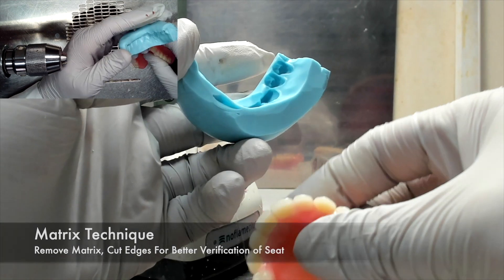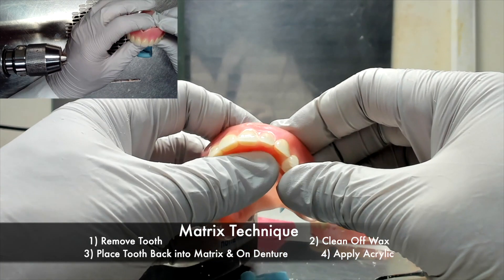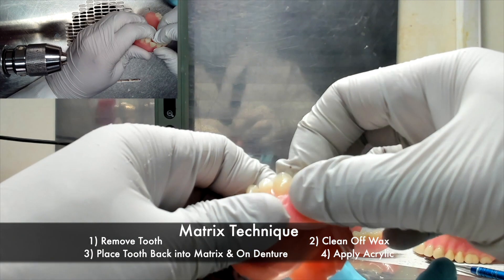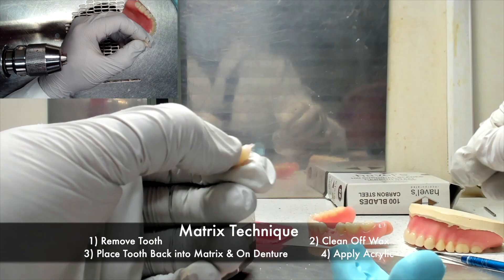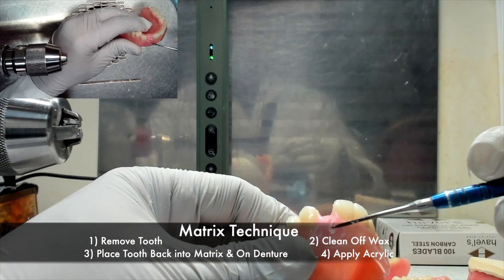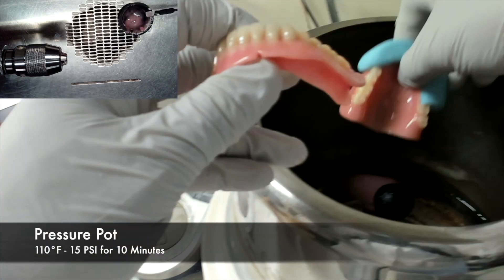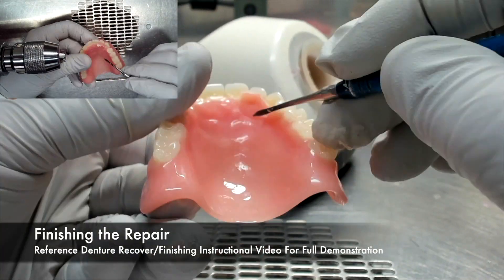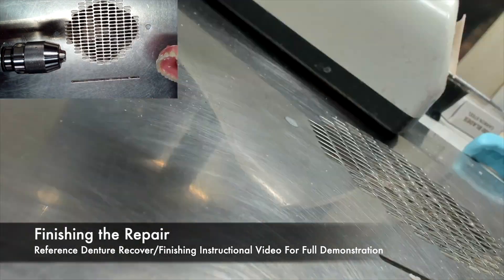The next steps are similar to the freehand technique and are as follows. You would remove the denture tooth from the denture and clean off the wax from all surfaces including the denture base. You will then place the tooth back into the matrix and onto the denture, and then apply your acrylic accordingly. The repair would then go back into the pressure pot, and once the proper time has elapsed, the denture is recovered from the pressure pot and finished.